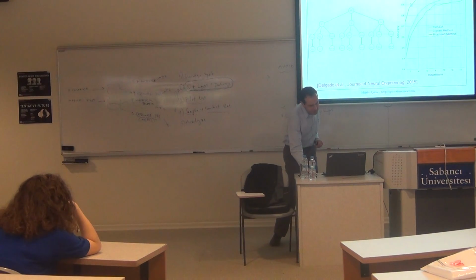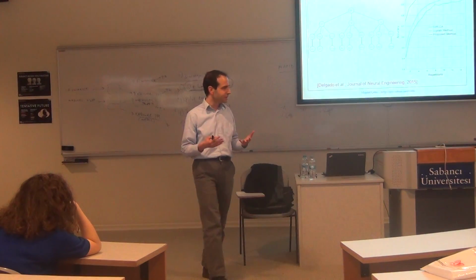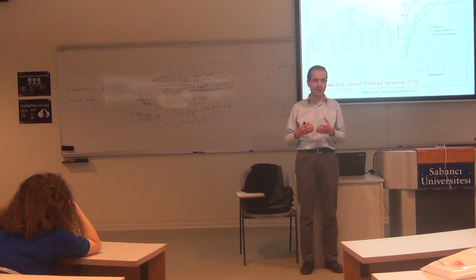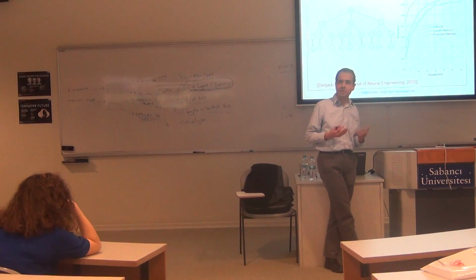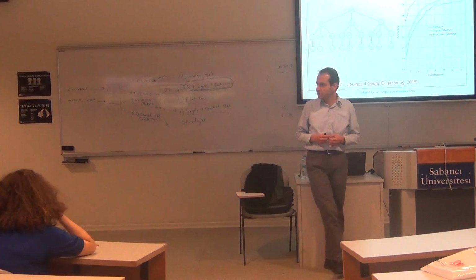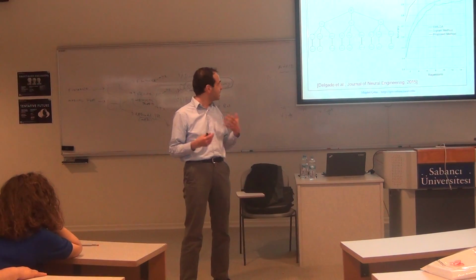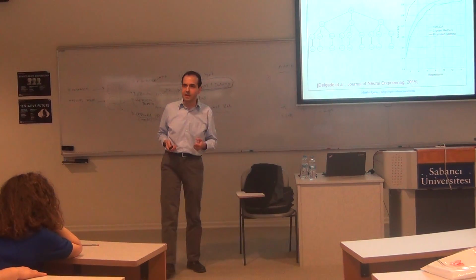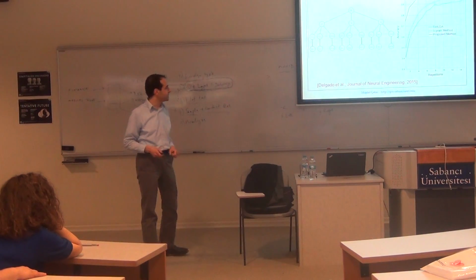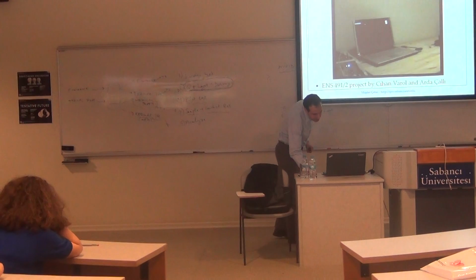The other thing we do is that you can do it at the letter level. You can also do this at the word level. That is, let's say you have an application in which you know that the subject is trying to type using a vocabulary of something like 5,000 words, which is something that's plausible for patients. Then you can exploit that information as well. If you know the words that the person is trying to type from, then maybe from the first 3 letters you also already can figure out what the person is trying to type. So let me skip that as well.